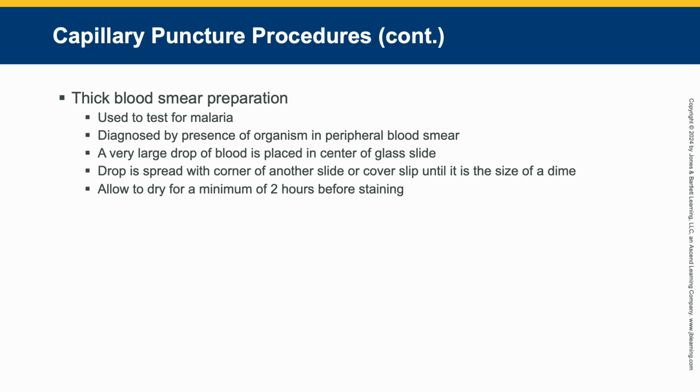So this is different. You're going to spread it out with the corner, make it the size of a dime, then they're going to stain it in the lab, and this allows you to be able to see if they have malaria in those slides, but you need to dry it for 2 hours.